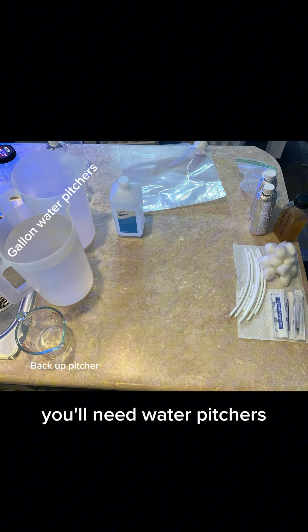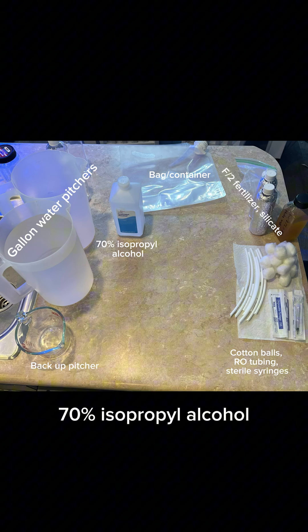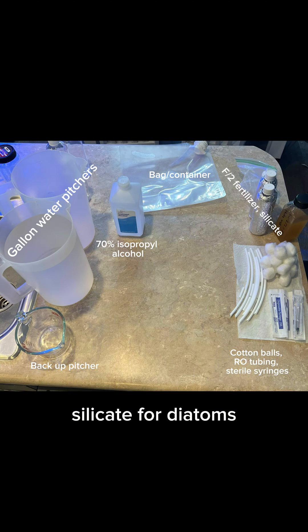You'll need water pitchers, 70% isopropyl alcohol, a bag or container, F2 fertilizer, silicate for diatoms, tubing, cotton balls, and a pipette or syringe.